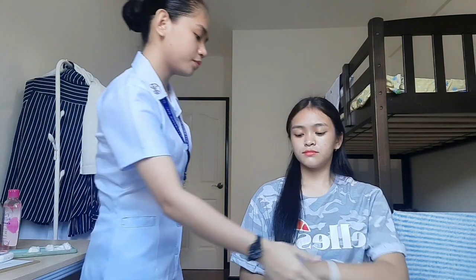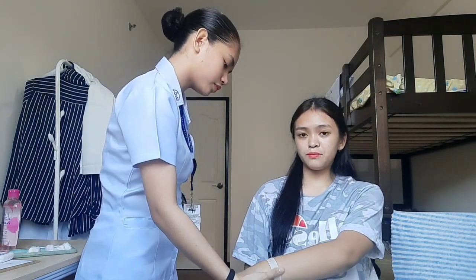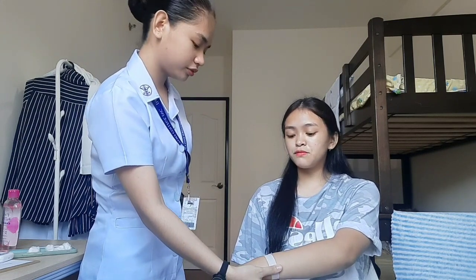So, ma'am, my name is Kyle Angeline Pioquinto, your student nurse for today. May I know what's your name? My name is Kate Dayan A. Pitugo. Your birthday? December 15, 2003. Okay, thank you. So, ma'am, we are going to check your body's temperature. Is it okay with you po? It's okay. Okay, thank you.